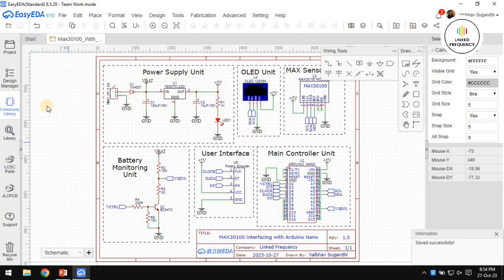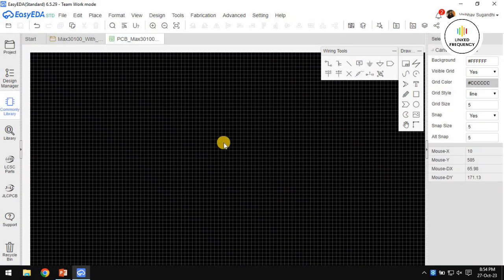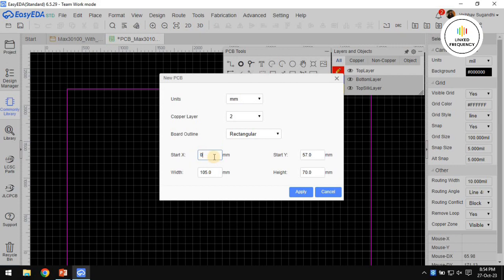A beautiful electronics. Okay, so now let's jump into the PCB designing section. I'll just convert it to a PCB layout, and let's fast forward to design it the way we design it.